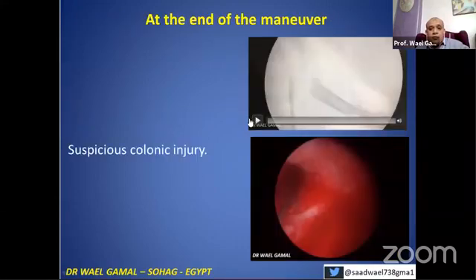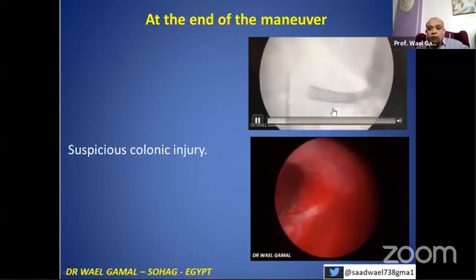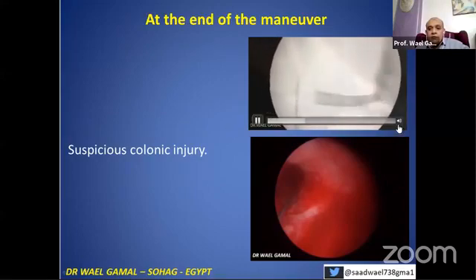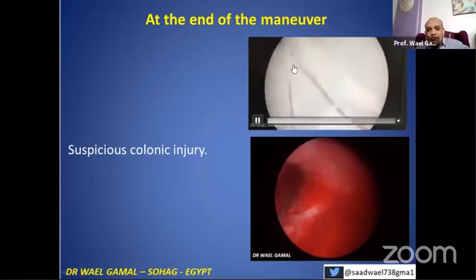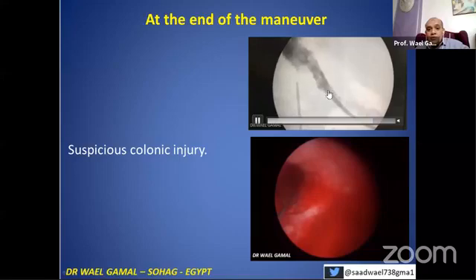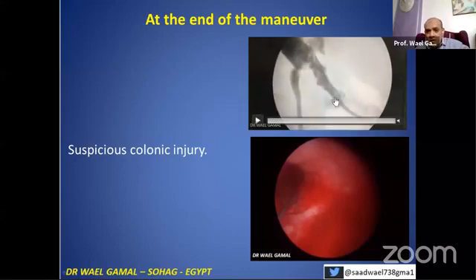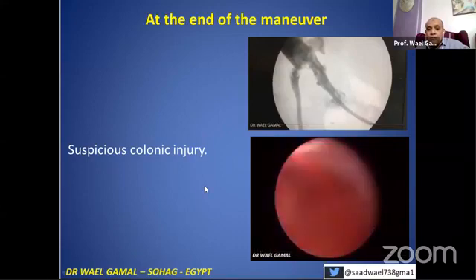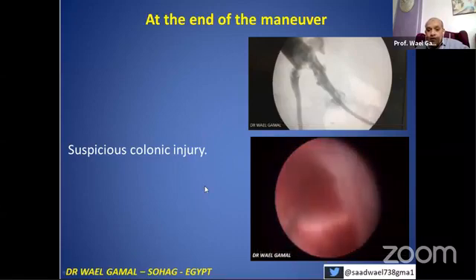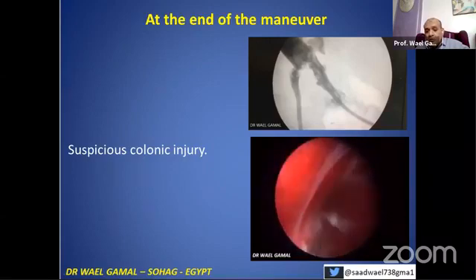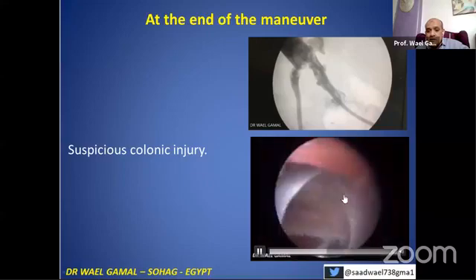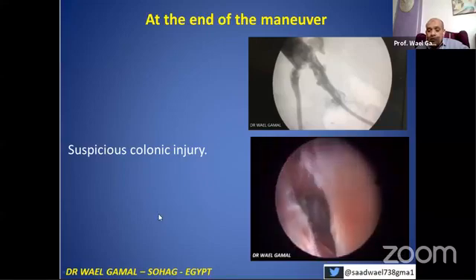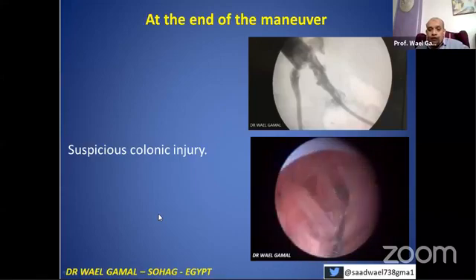If you suspect a colonic injury at any time, you can intraoperatively inject dye to do a nephrostogram. If there is colonic injury, you will see the dye inside the colon. Or sometimes you can assess it visually — go visually exploring the tract. Here the tract is healthy, nothing abnormal, this is the muscle, there is no colon. You need visual exploration of the tract.